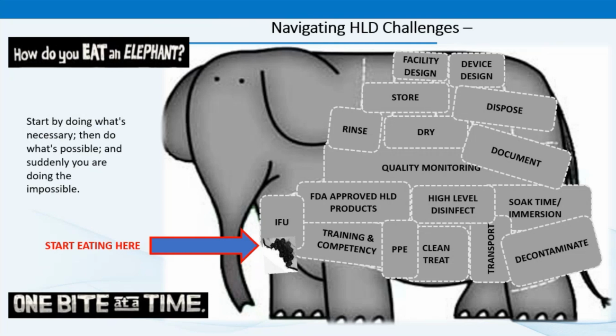Rinse the device with the indicated water per the IFUs under the surface of the water while agitating to minimize splashing. Dry your devices thoroughly to avoid dilution of HLD. Rinsing and drying remove residual disinfectants and prevent bacterial recontamination.